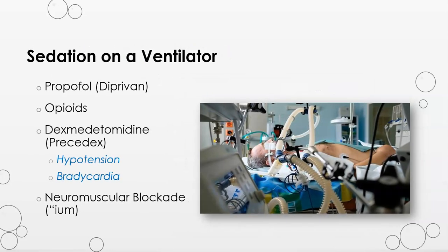Speaking of sedating patients, being on a ventilator is anxiety producing. Think about doing all of your breathing through a straw and how that might make you feel. The tube can cause the patient to gag. It is uncomfortable. The patient cannot communicate, and there is much oxygen consumption when the patient has anxiety. Therefore, it is important the patient remains sedated while on mechanical ventilation.